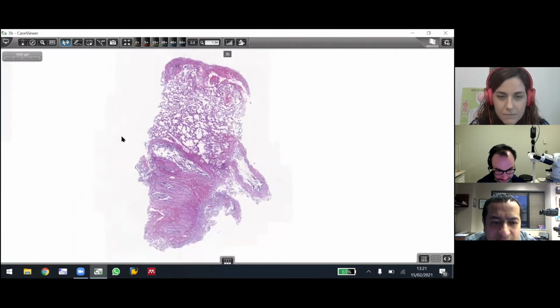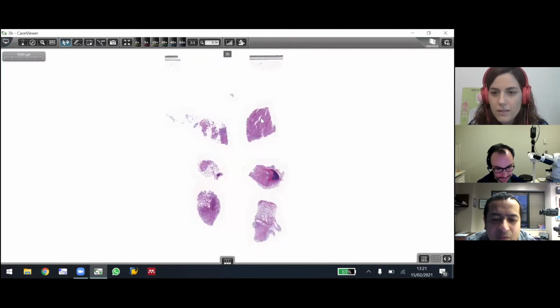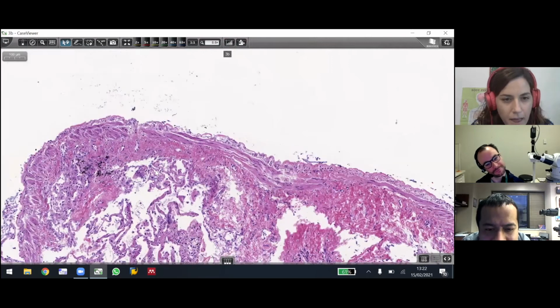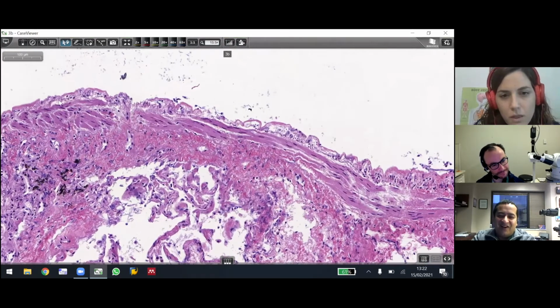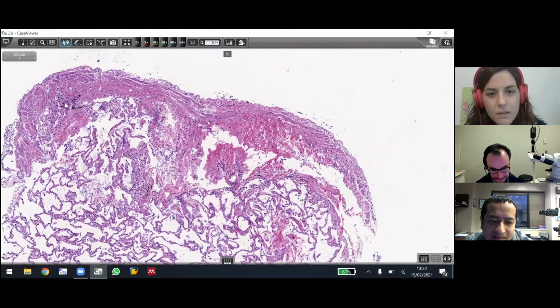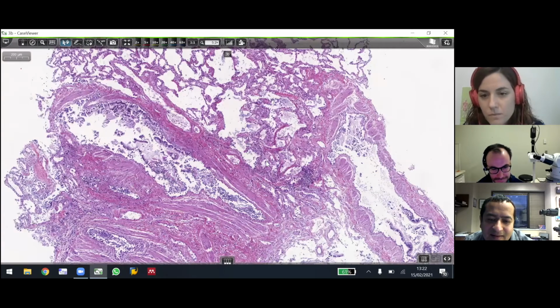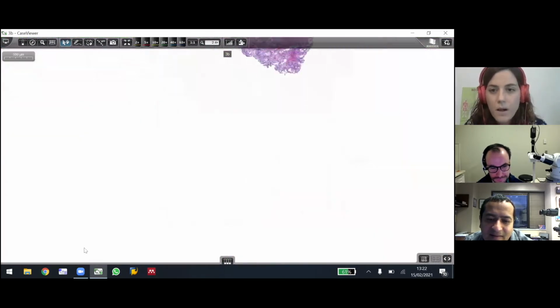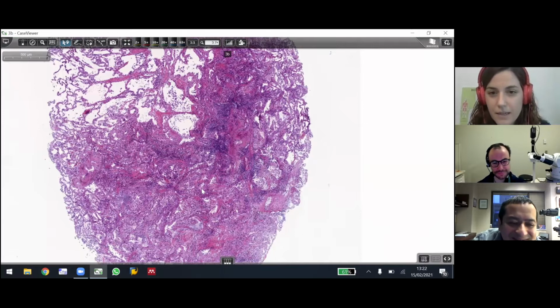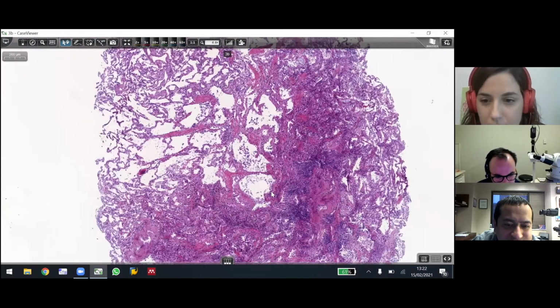So is that pleura? No, I don't think so. Is that interlobular septum right at the top of that piece? No, I don't think so. What is that? Is that a blood vessel? I thought it was a bronchus. Okay, without the epithelia. Yeah. No, because I have the anthracosis here. And this is my best piece. In the other card, we saw here the vessel and the bronchi. And here we see again the same inflammation and this.